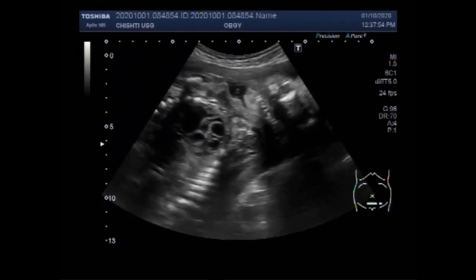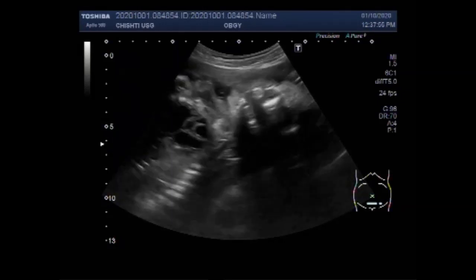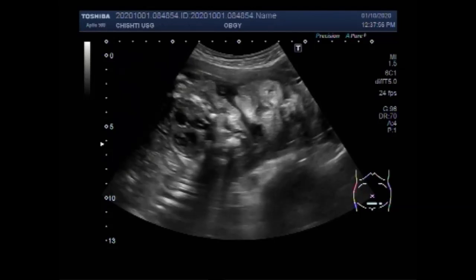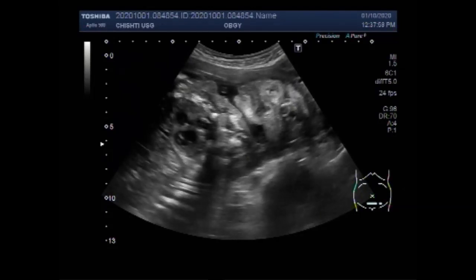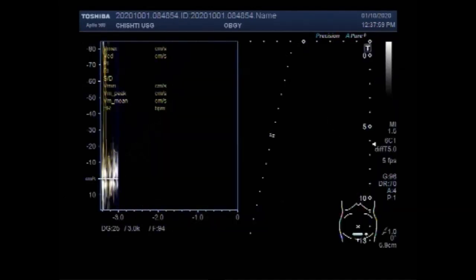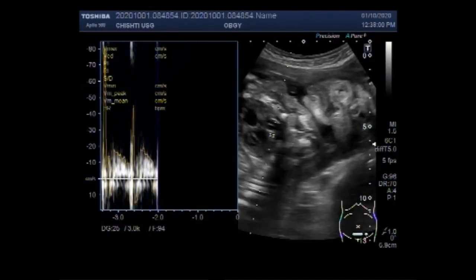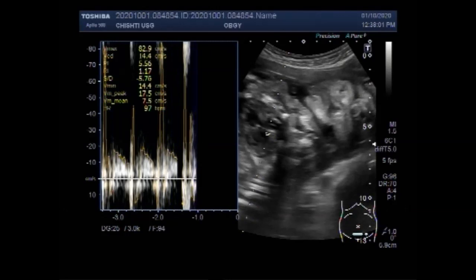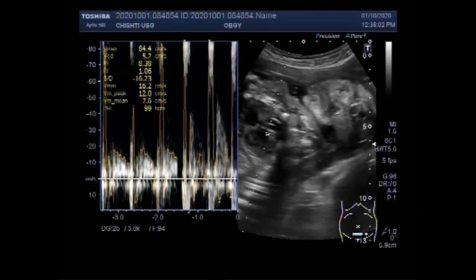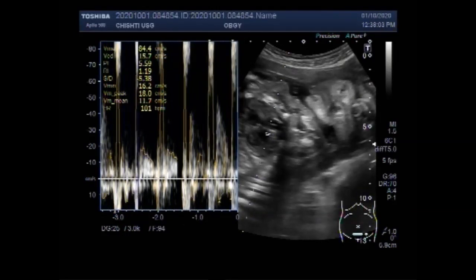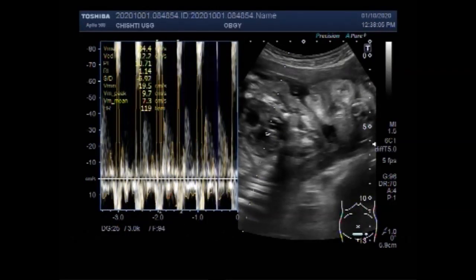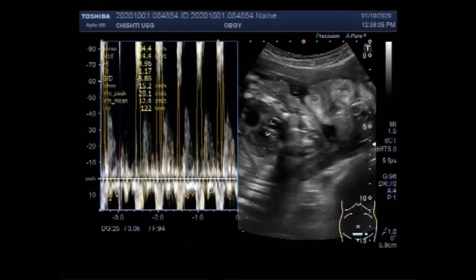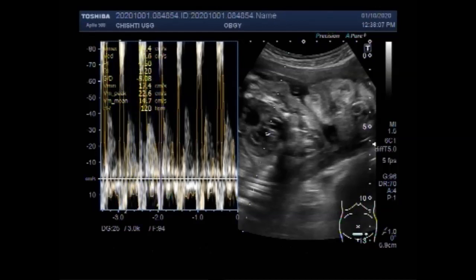Now you can see the fetal cardiac activity again, and now it shows almost normal heart rate.